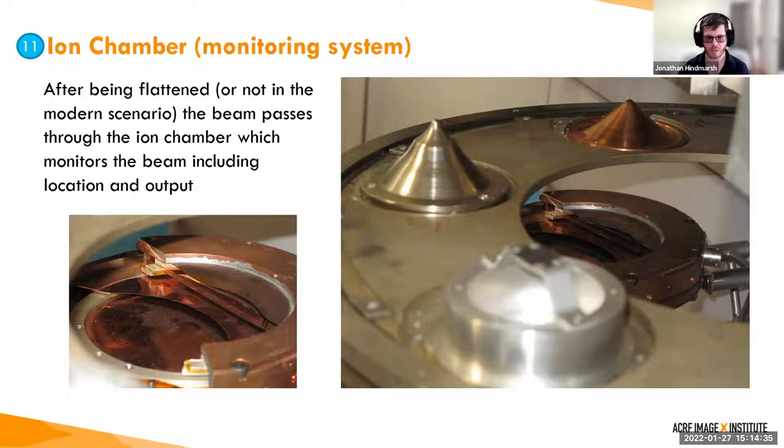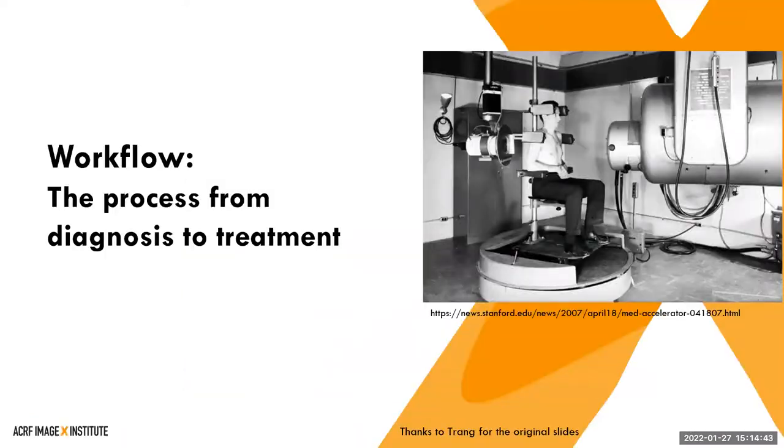There are some really good papers out there. I probably have them. If you want to know more, hit me up afterwards with an email. If we see that the beam position is not correct from those two chambers, what is done then? That's all controlled digitally within the Linac system. On a normal treatment, it's not monitored. Physics does QA on the beam shape on a routine basis, when the machine is commissioned, on an annual basis, or when needed. The left, right, in, out position is controlled and then set as the reference, and so the machine always drives to that reference.